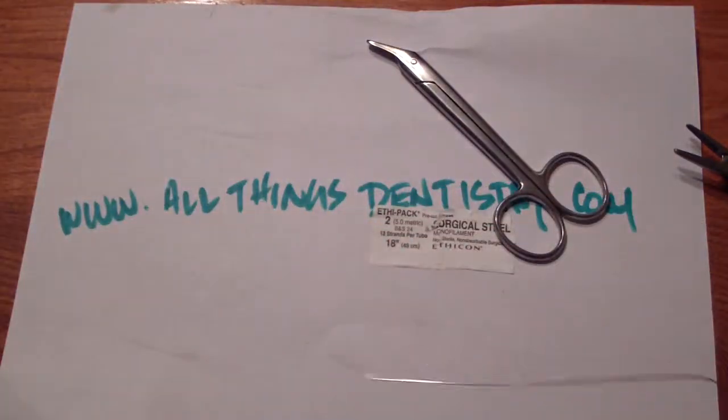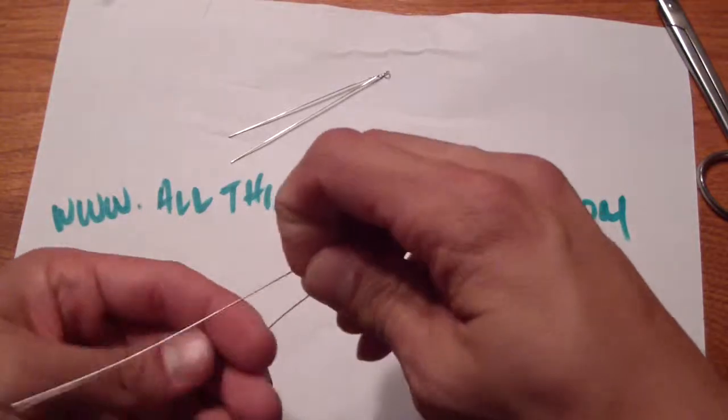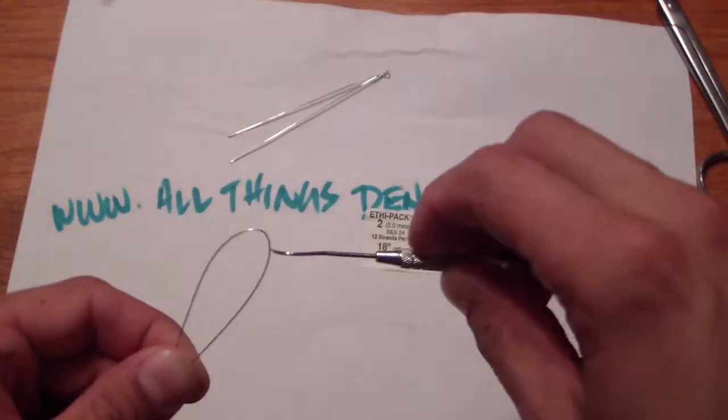It looks like it's just bent, but it actually is stretched. What we're going to do is make a little loop — I need to make it look like that. To make the loop we're going to use something small like an explorer, just the tip of an explorer.